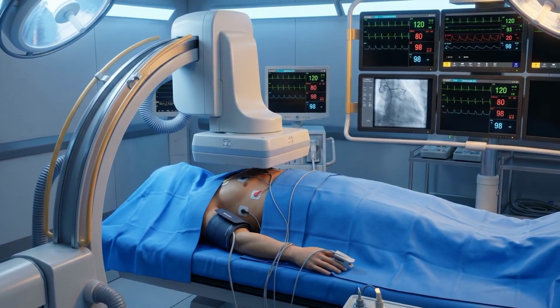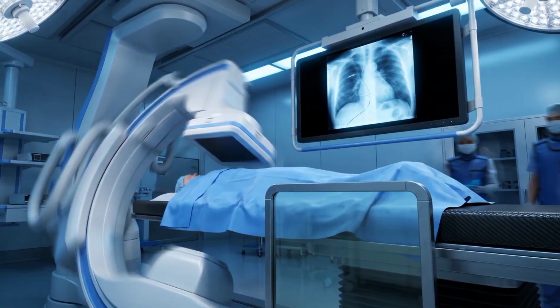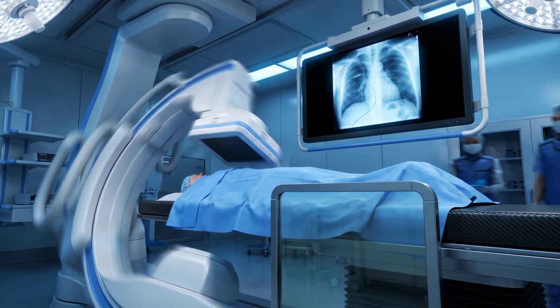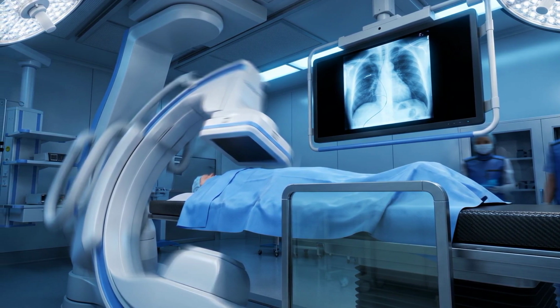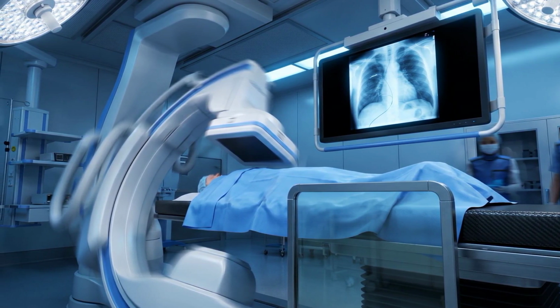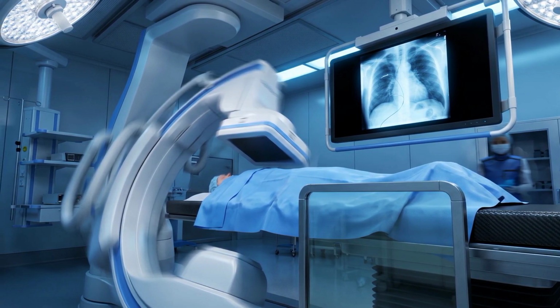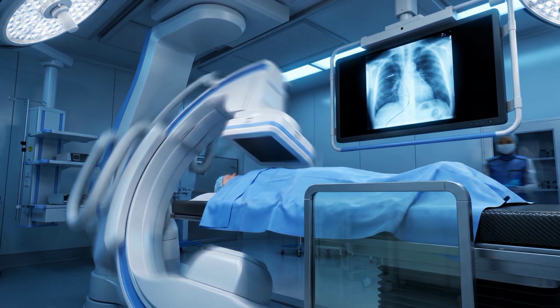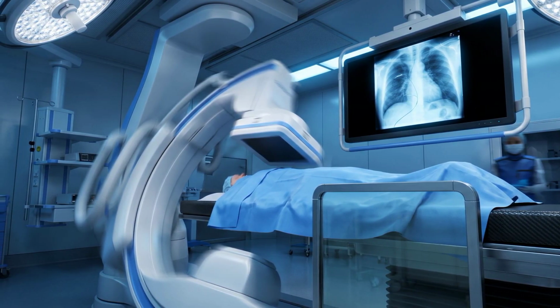To make the blood vessels visible, a special contrast dye is injected through the catheter. As the dye flows through the coronary arteries, the X-ray system captures live images. You can see the live images in the image, allowing doctors to clearly see any blockages. This process is called angiography. You might have heard this word angiography many times.